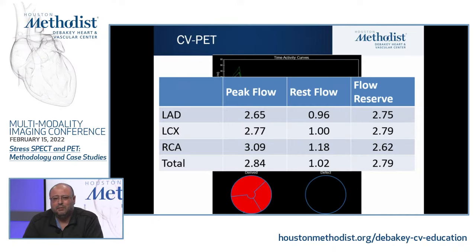have been occluded, but it may be just native vessel disease and microvascular disease, or disease distal to the grafts, that these patients have kind of diffuse disease. So I still feel that a normal flow in these patients is more reassuring. However, the reverse doesn't always mean that it is alarming. Yeah, thank you.